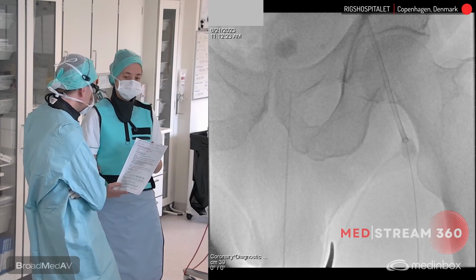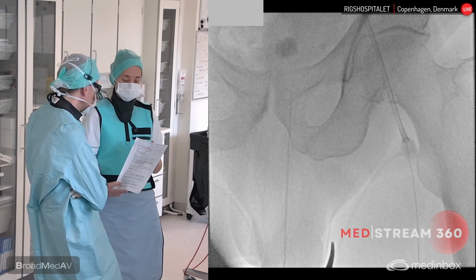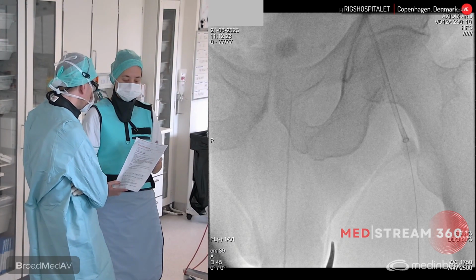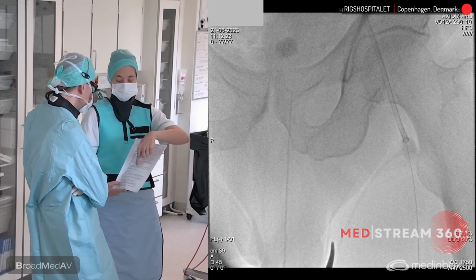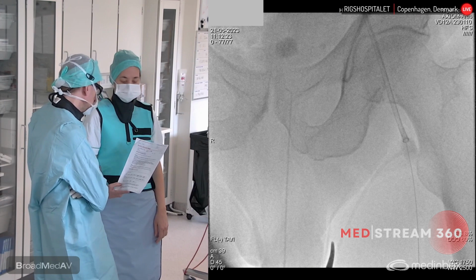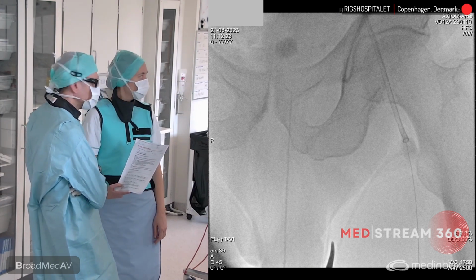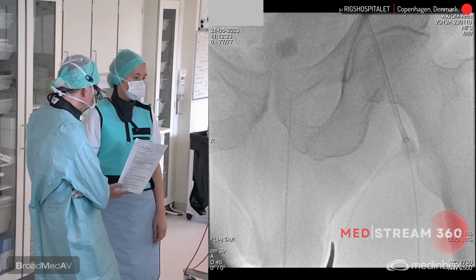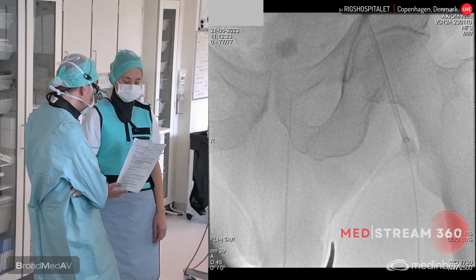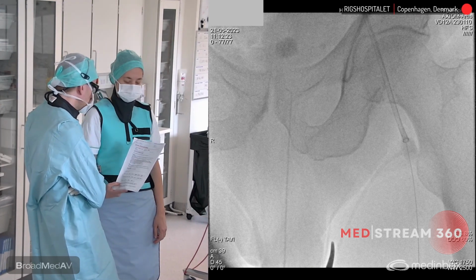And then he had a coronary angio that showed a closed intermediate vessel. He had a stenosis on the LAD, which was RFR apparently negative or what? Yes, he was positive because it was 0.69. He got PCI of the LAD before, and now he's on double antiplatelet therapy. His renal function is preserved. His ECG looks fine. PR is normal, 140, QRS 104.